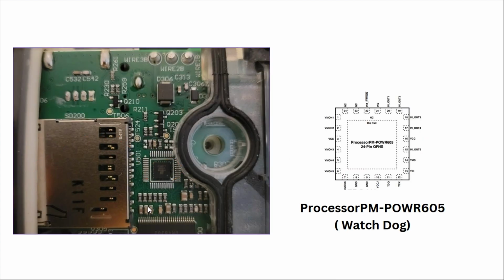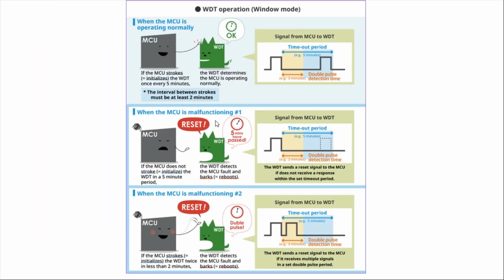Now, if we move slightly up the board, we have two other main components. One is a watchdog timer, and then we additionally have an SD card adapter there for taking in data as well. The way a watchdog usually works is that it monitors the status of the main processor unit by receiving timed pulses. If it doesn't receive a pulse within a certain amount of time, we know that we need to reset the main microcontroller, as it's not operating properly.